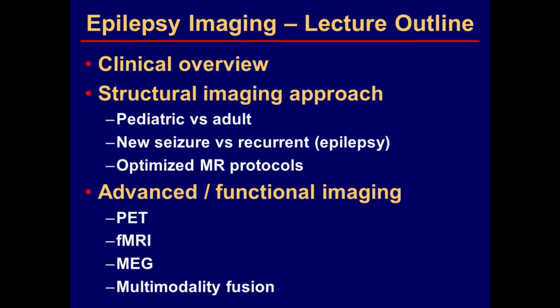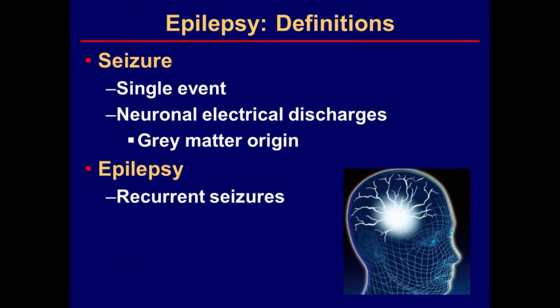And in the end, we have to recognize that epilepsy is not a structural problem. It might be caused by a structural problem, but we have to recognize the importance of functional imaging and direct evaluation of the electrical circuits in these cases, particularly the refractory epilepsy cases, to better understand what's actually causing epilepsy in this particular patient. And we'll come to that at the end.